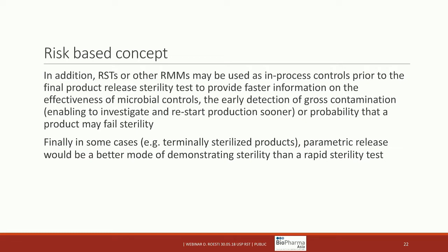Now, the best way, of course, and the fastest way to release a product to the patient would be to use parametric release. So not to perform a sterility test, but base yourself on the sterilization parameters, like for instance in heat terminally sterilized products.